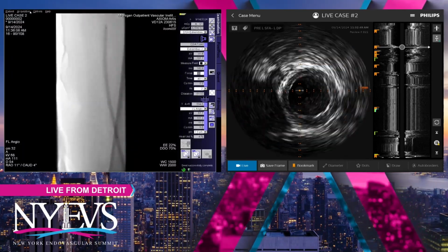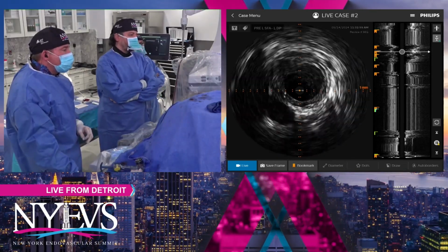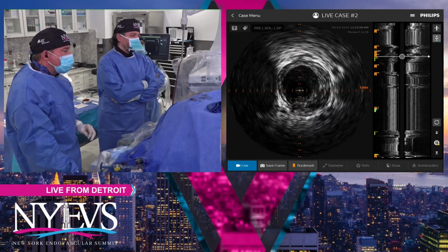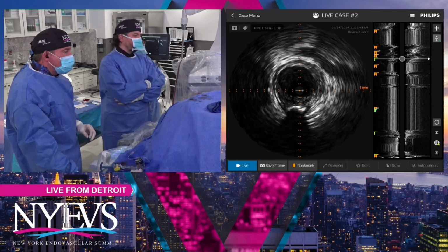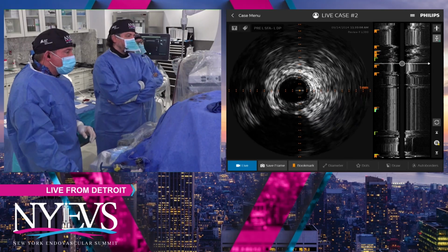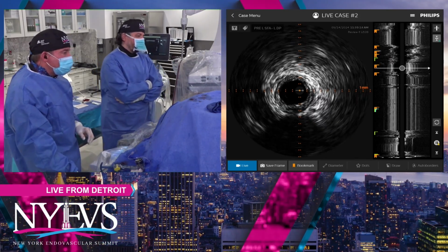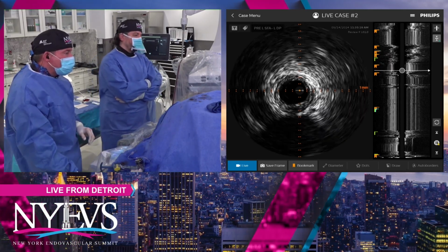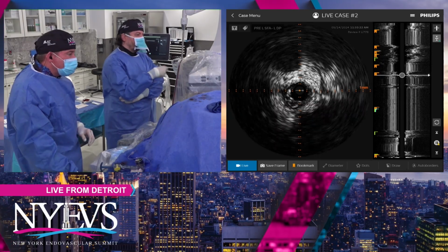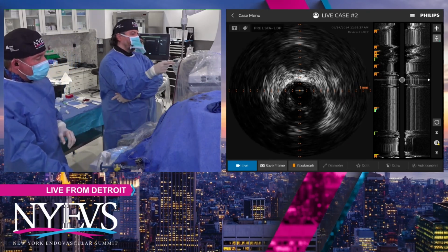Yeah, they're both good questions. If you can see the IVUS run, I essentially use IVUS 100% of the time if I can. Again, I think the data is pretty compelling in terms of sizing, position, nature of the atheroma, and so on. Here you can see areas of positive, I don't know if it's remodeling, we're guessing, but you can see the different sizes of the vessel even within the SFA itself. It goes from 6 millimeters to 5 millimeters. But I want to point your attention to this area right here. You notice there is an area, this is in the AT.